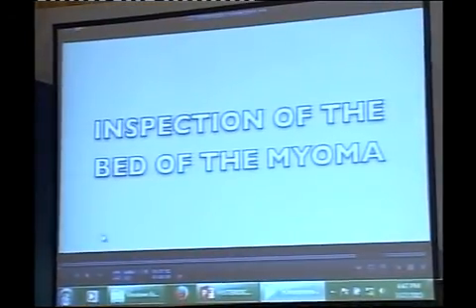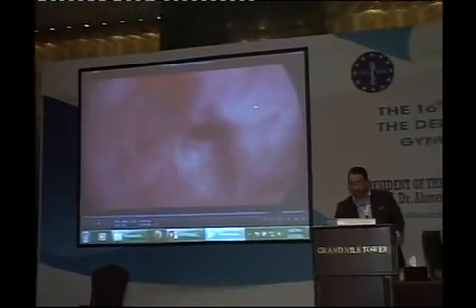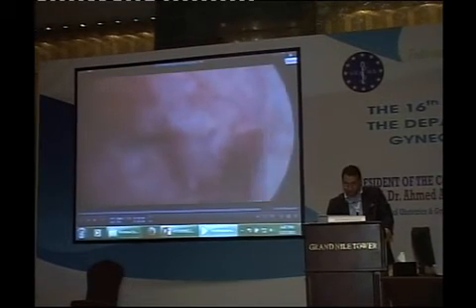Once the bleeding points can be seen, the intrauterine pressure is increased back again and the coagulation is performed simultaneously to seal the bleeding points. The procedure is completed by inspection of the bed of the myoma, as you observe in this video.